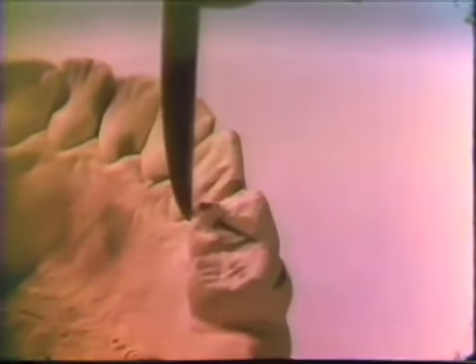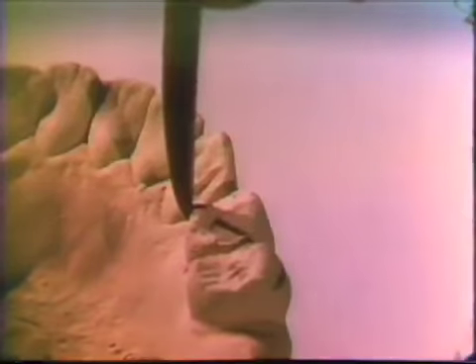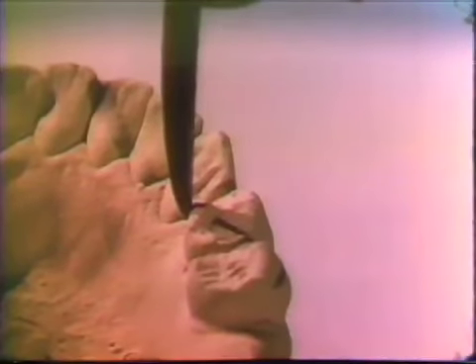Lingual surfaces should be checked for relative parallelism and to locate areas which might interfere with placement of the appliance. Soft tissue contours are examined for possible areas that will interfere with seating of the framework, particularly the major connectors and the bases.